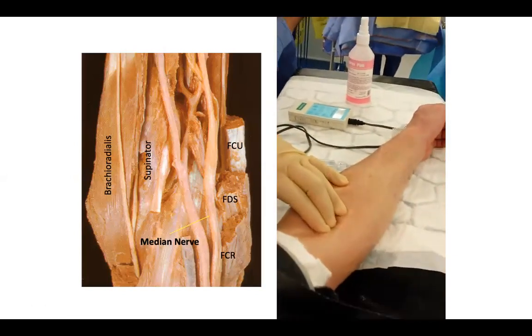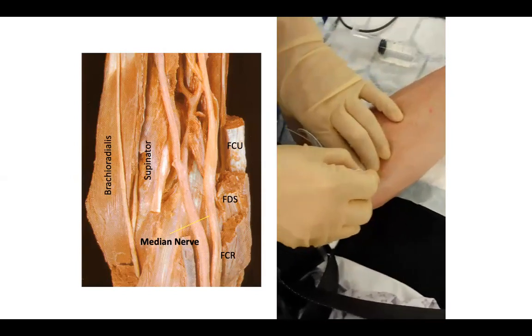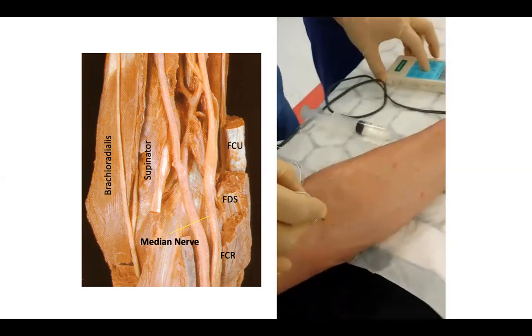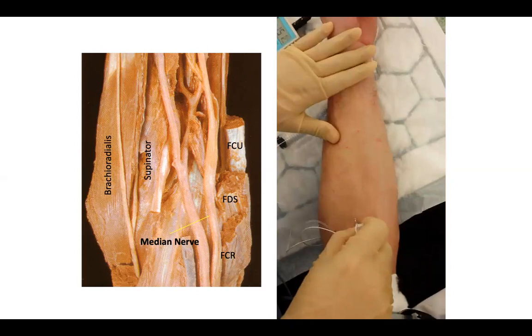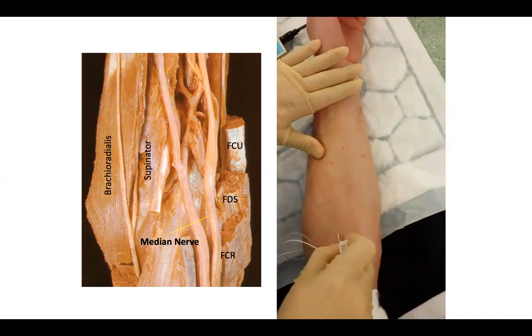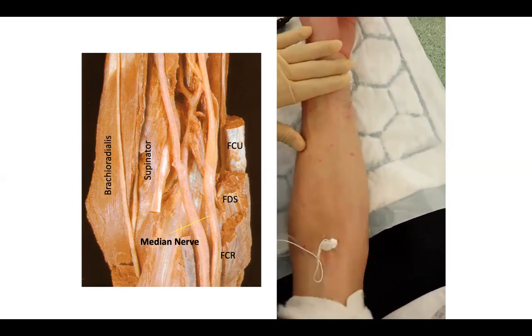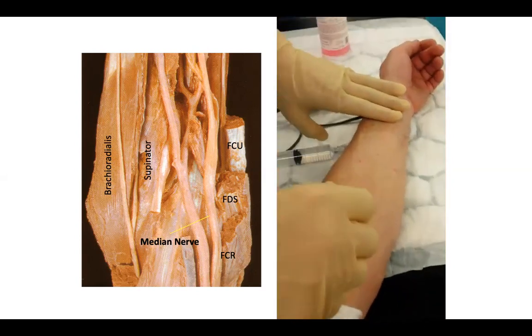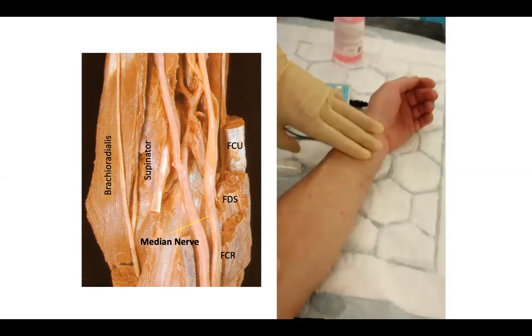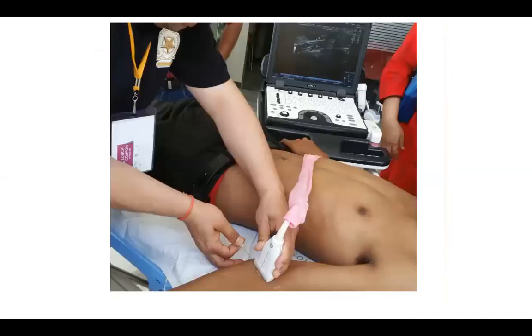To perform the median nerve block with nerve stimulation, feel for the brachial artery and go medial to it at the elbow crease. You should get a typical median nerve response. The median nerve supplies the pronators, so you will see the wrist and hand going into pronation. If you are slightly below the crease the nerve is a little deeper, so being slightly more proximal makes it easier to get the response.